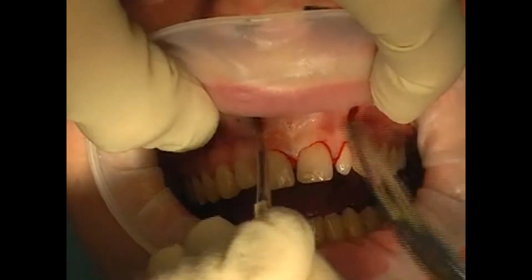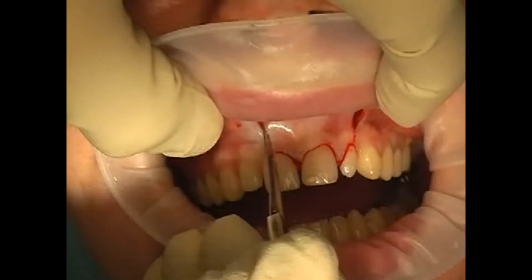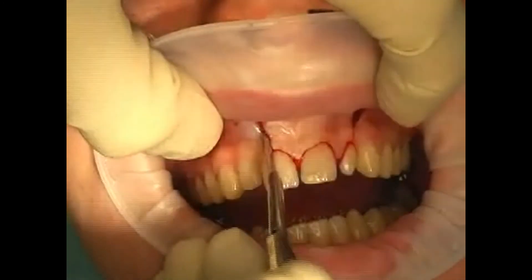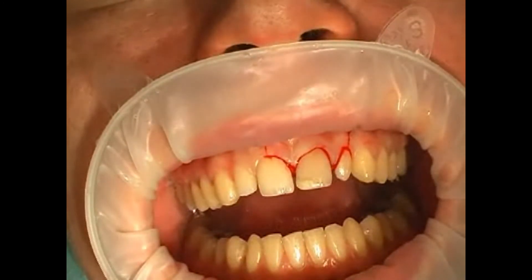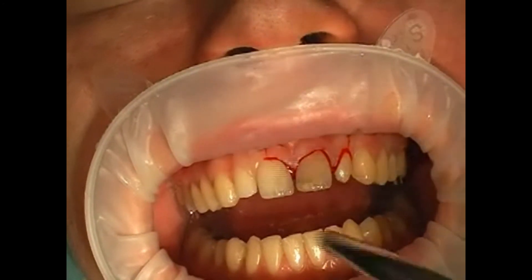In normal, cautious cases, there is very little or no resorption of the gums after such a surgery. Today, the gingival margin cut is the preferred type of incision cut, and can also be safely used on artificial crowns.